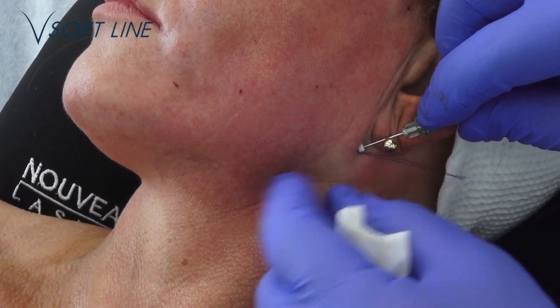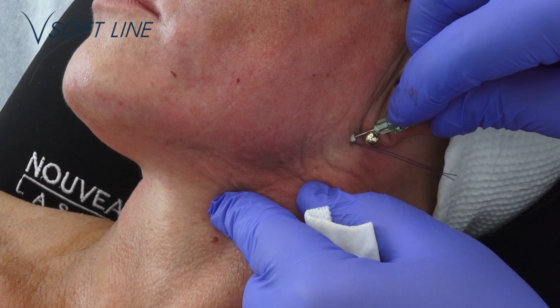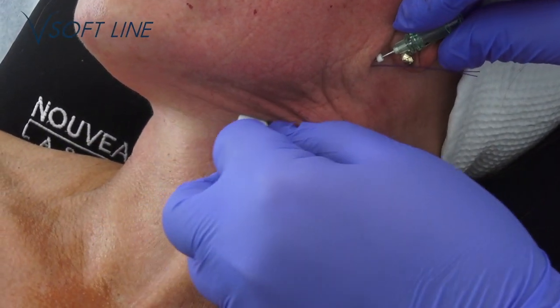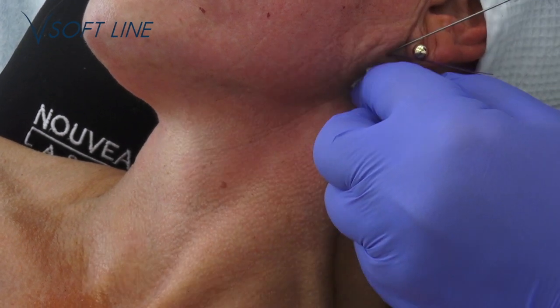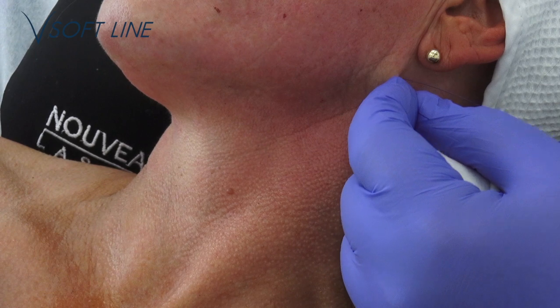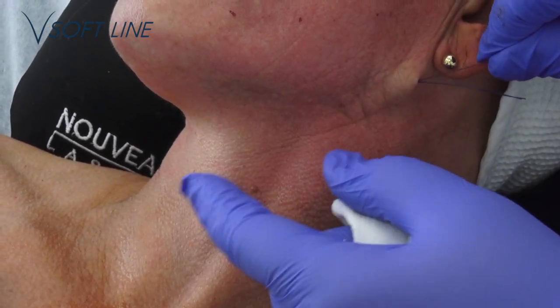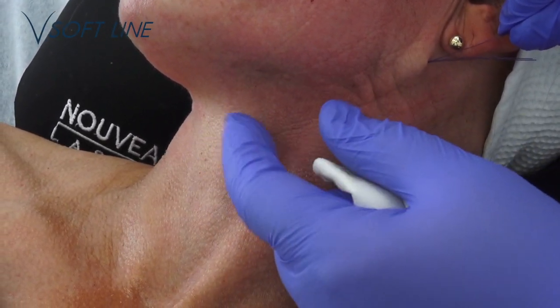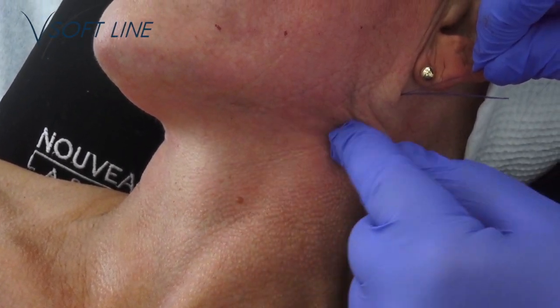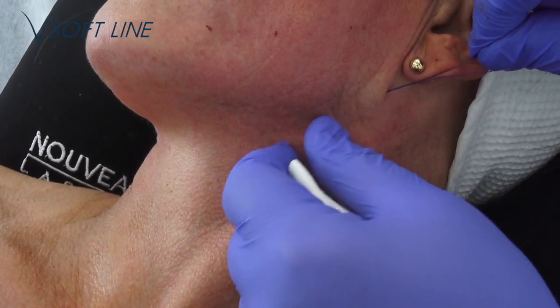We are still using barb blunt cannula L 21G 90, 4 cannulas. 21G sharp works just as well. It's often easier to work with, and sometimes it hurts less. But a blunt cannula is safer, since you avoid the risk of hitting a large blood vessel.